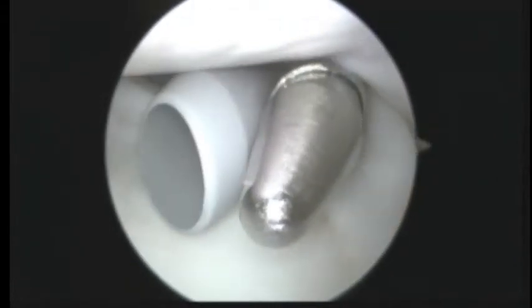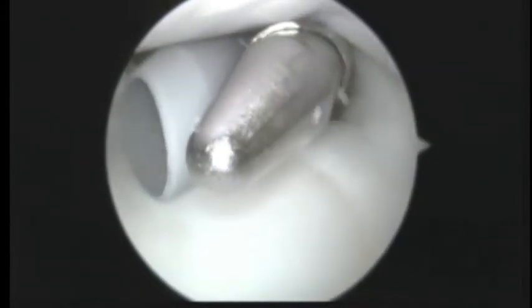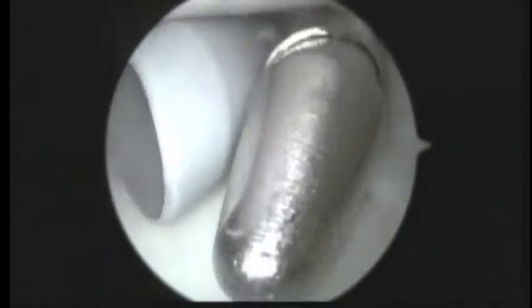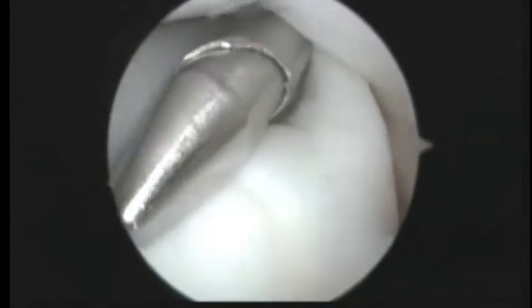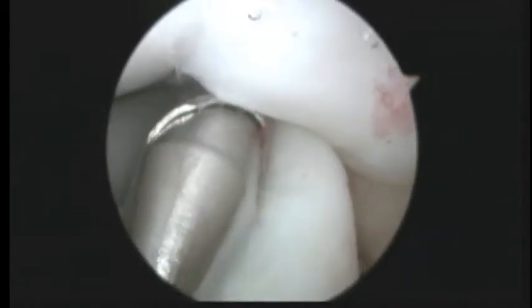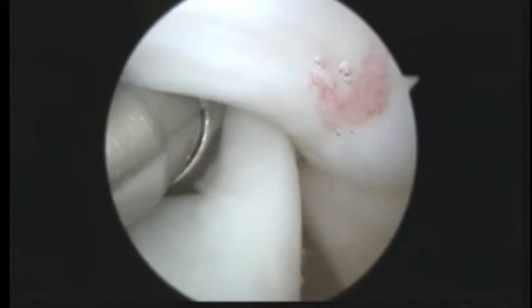Like we talked about, we examined your shoulder before we started, and there was significant instability both anterior and posterior. So we're expecting to have to tighten the ligaments both in the front and in the back of your shoulder. So this is our first look inside. To the right of this metal cannula is your biceps tendon.